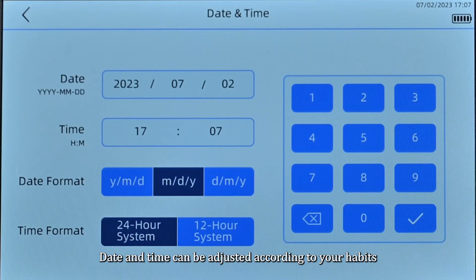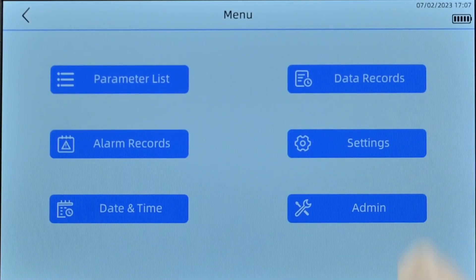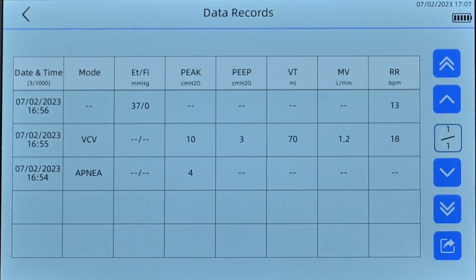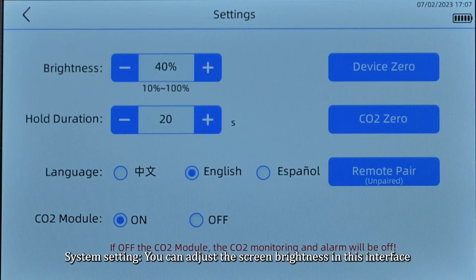Date and time can be adjusted according to your habits. Data recording allows the data parameters used during the operation to be exported with a USB disk to facilitate alarm analysis. In system settings, you can adjust the screen brightness.